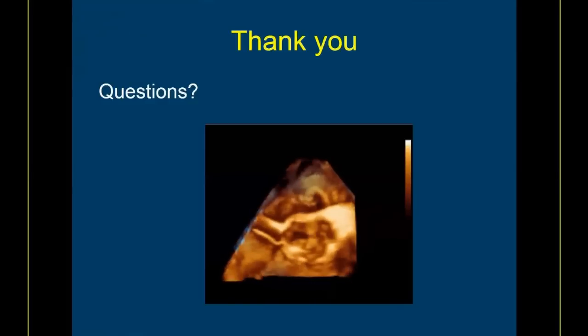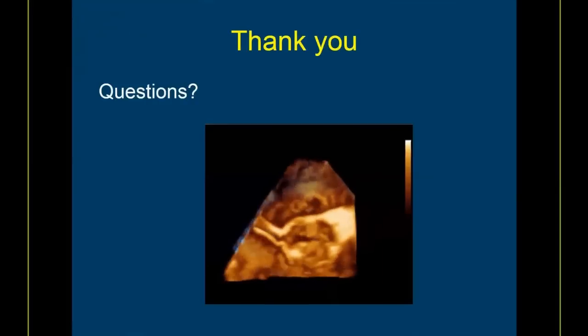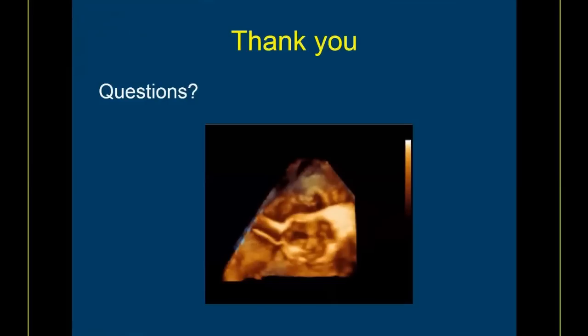Here's another great question, which I picked because I don't always have the answer, but it addresses interesting physiologic issues: low flow, low gradient aortic stenosis and mitral regurgitation. What degree of MR would contribute to low flow, low gradient AS? This question highlights how to address concomitant mitral regurgitation in severe aortic stenosis. If you have significant MR, 40% of your available ejection volume is now going backwards. It's not going forward, so it's effectively a low flow state, even if you don't have a hypertrophied ventricle.